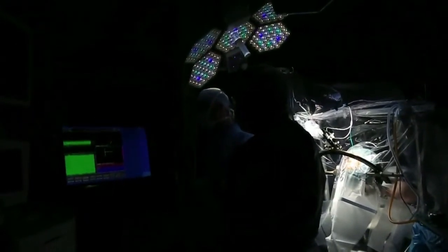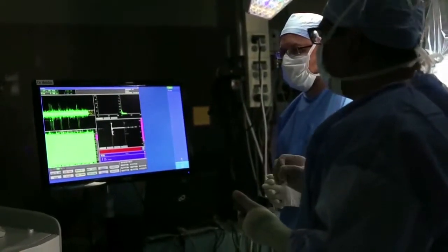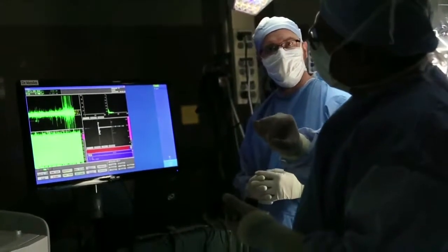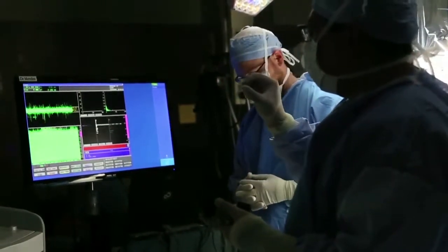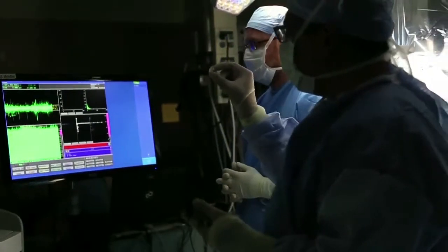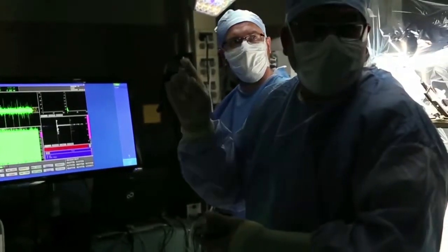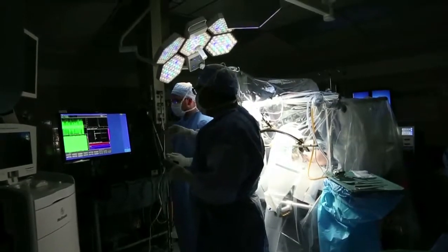So this is an opportunity for you to listen of how the brain actually sounds. What is the voice of the brain? Okay, can I listen to that? So all these ticks are the electrical impulses of individual cells. And when they come in bursts, you see it comes in a burst. There are several cells that are acting together. And now I'm getting into this area of transition where the cells are here very big.